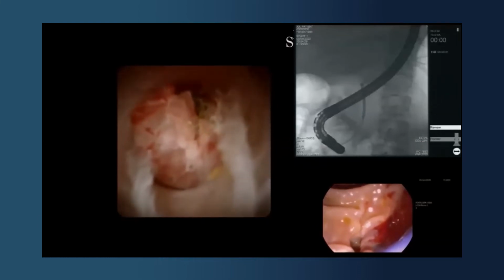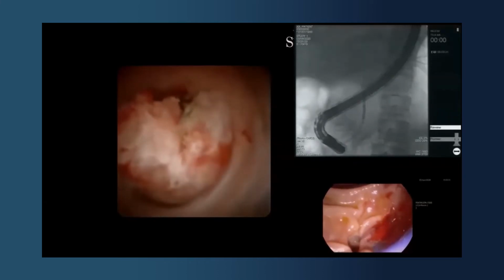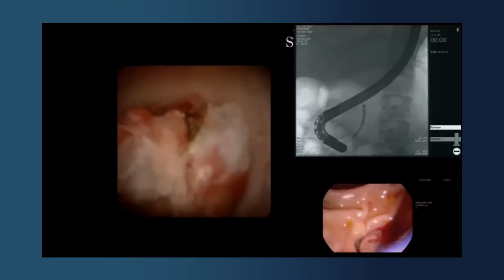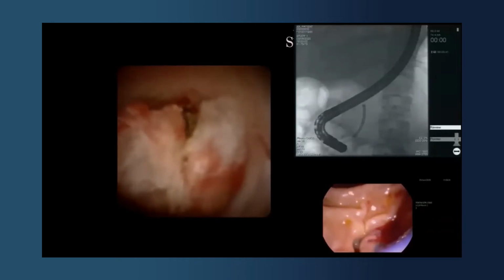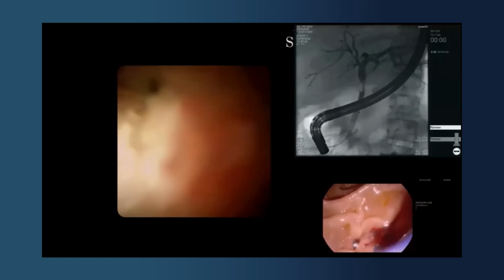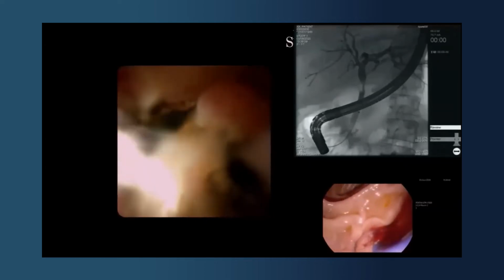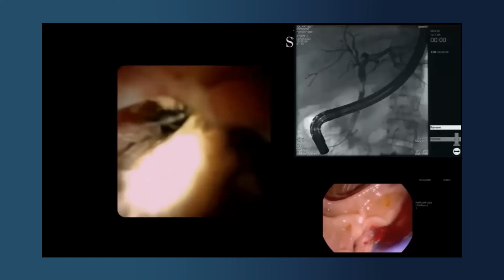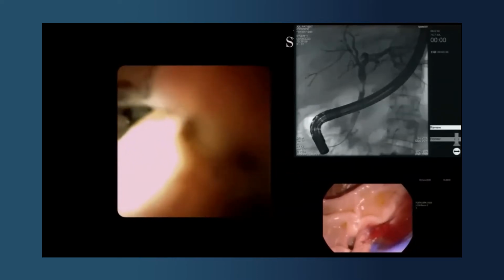And in the common hepatic duct, we saw this polypoid lesion, friable, with concern that this may be a polypoid tumor. But of note, on careful advancement above this lesion, there was a stone. And it was clear that the polypoid lesion was, in fact, a rather evaginated distal end of the cystic duct being carried into the bile duct by this stone.